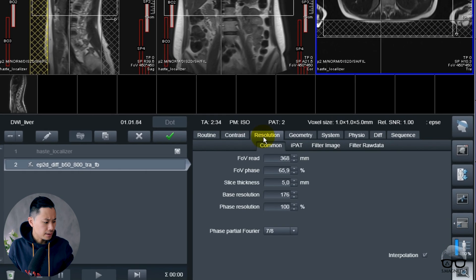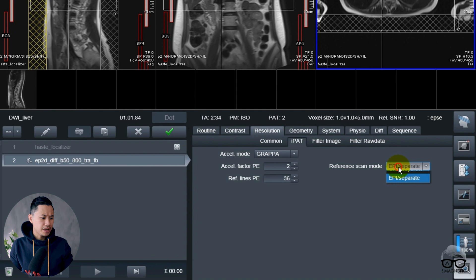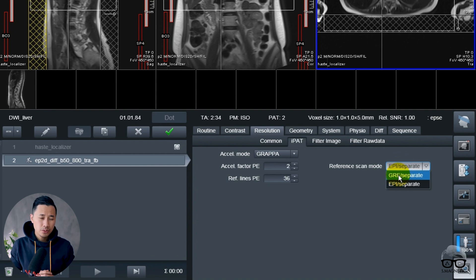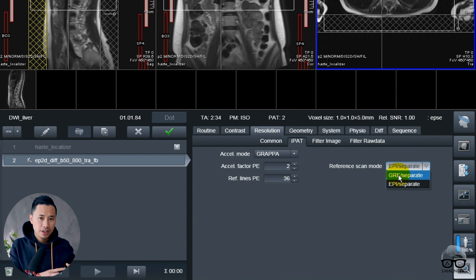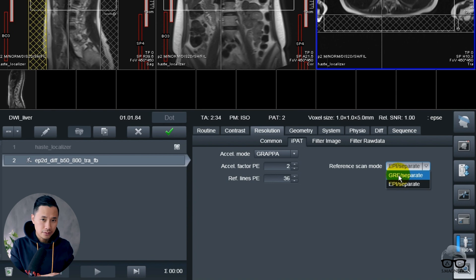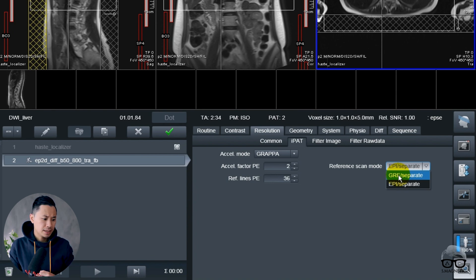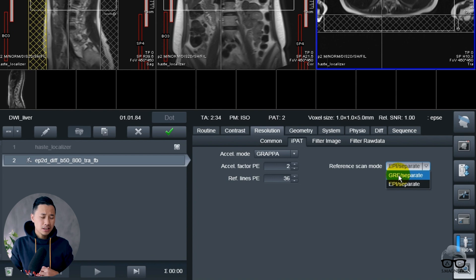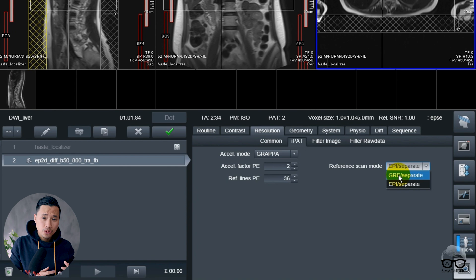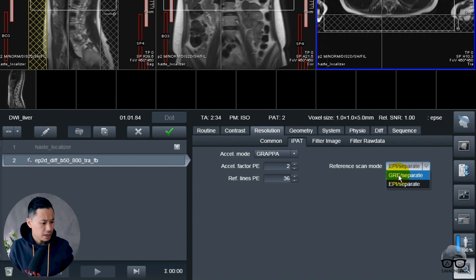So right here, you have two modes: one of them is gradient separate, the other one is EPI separate. Whenever you are looking in the Siemens tree and go to the diffusion in the live imaging, you can see that it's standard with the gradient separate. The sources say that you should also use gradient separate, but I want to show you the differences. Let's try the gradient first.